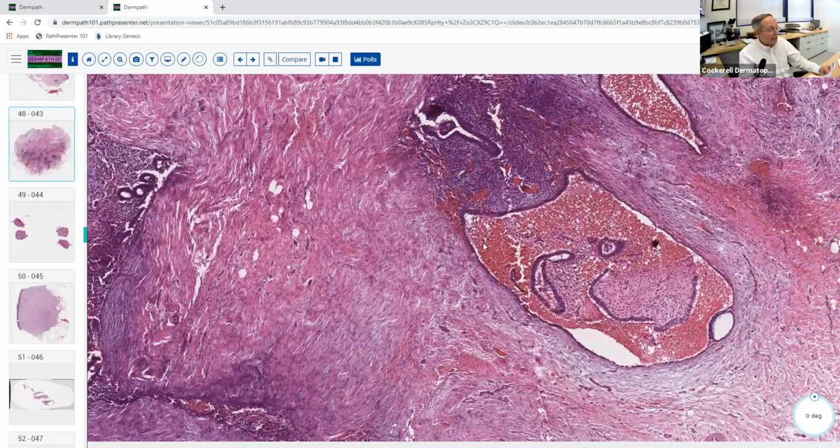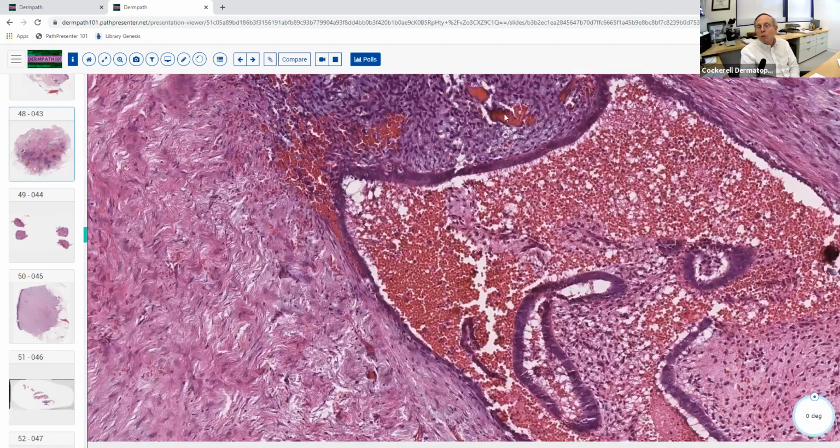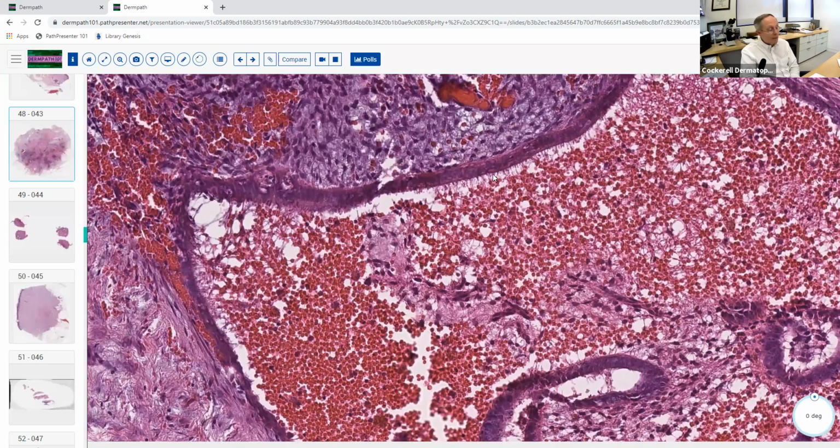No, it's clearly not that. Omphalomesenteric duct polyp is lined by gastrointestinal epithelium. Doesn't have a lot of red cells in it. So again, they're not going to ask you that either, because that's pretty bizarre. But if they do ask you that, it'll probably be in a multiple choice question with pediatric dermatology. And that wouldn't have this ciliated epithelium that you see here.